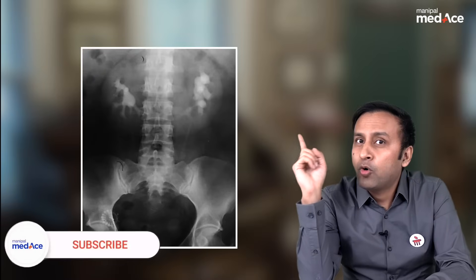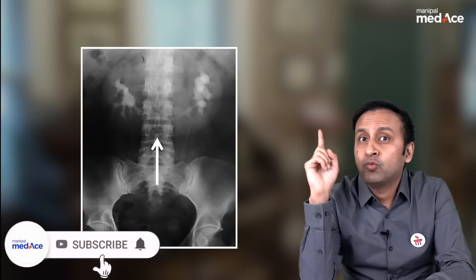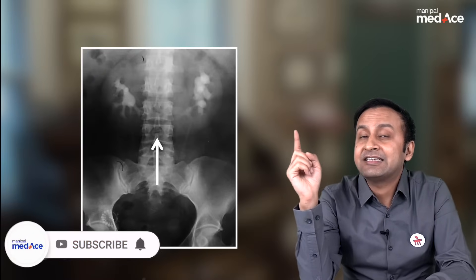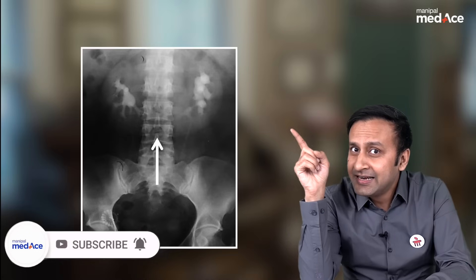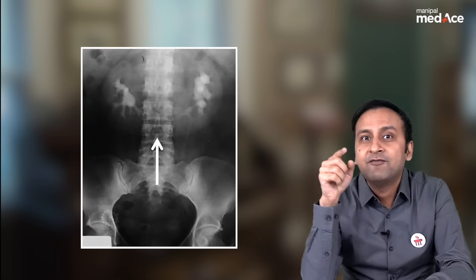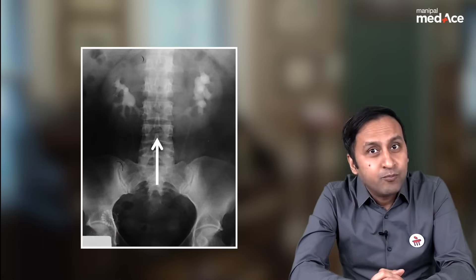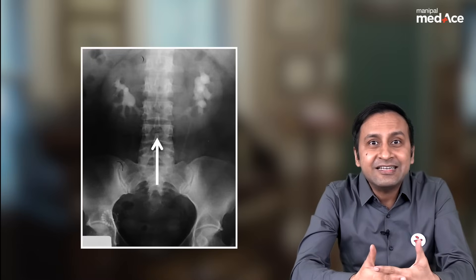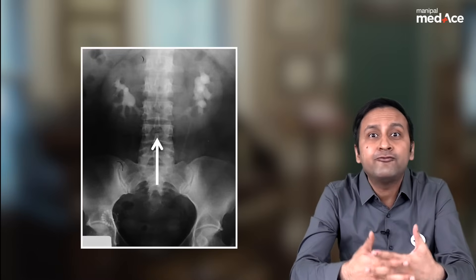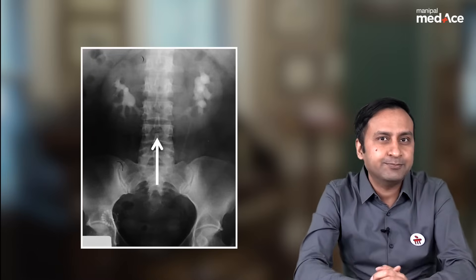What do you see here? Both the kidneys are lying slightly caudally, and there is this enhancing parenchymal band connecting the lower pole of both the kidneys. This is a classical example of a fusion abnormality of the kidney — specifically, a horseshoe kidney.